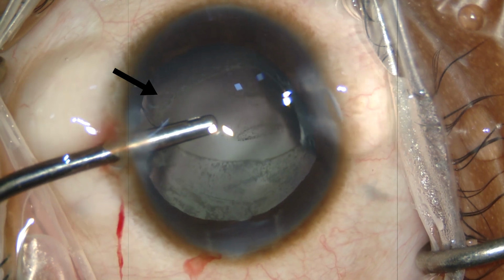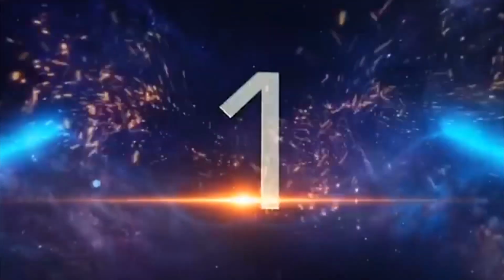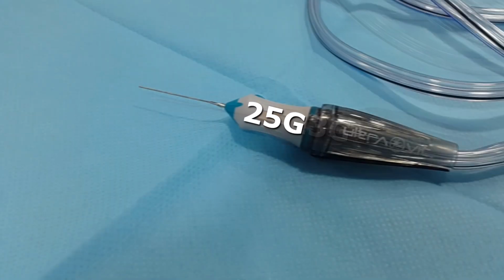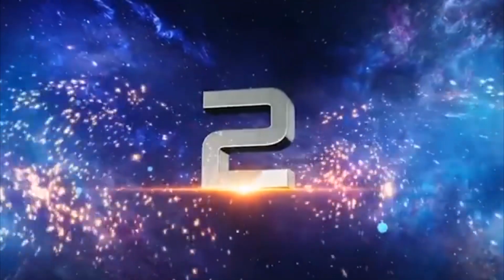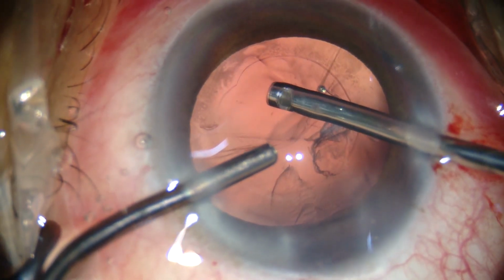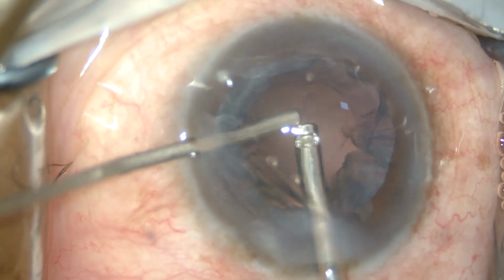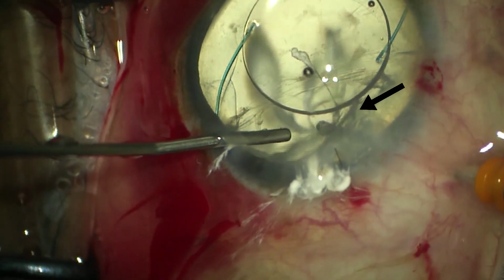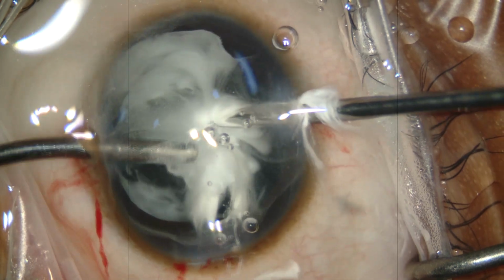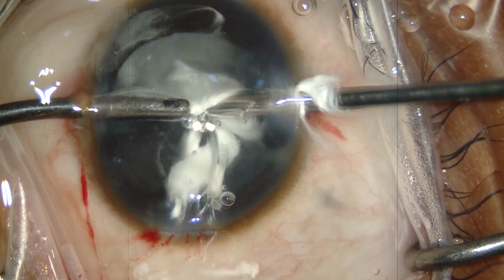Once you have a PC tear with vitreous loss, there are 4 important things we have to remember. Number 1, vitrectomy cutters, 20 gauge, 23 gauge or 25 gauge. Number 2, bimanual vitrectomy. By bimanual I mean there is a separate anterior chamber maintainer and a separate port for the cutter. Number 3, limbal anterior vitrectomy or pars plana anterior vitrectomy. Number 4, use of preservative-free triamcinolone in the anterior chamber to delineate the anterior vitreous for the anterior vitrectomy, either through the limbal or the pars plana route.